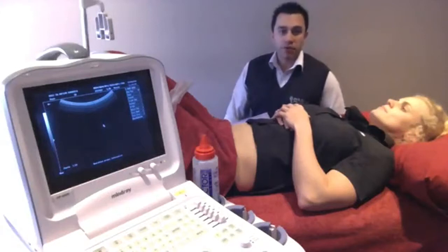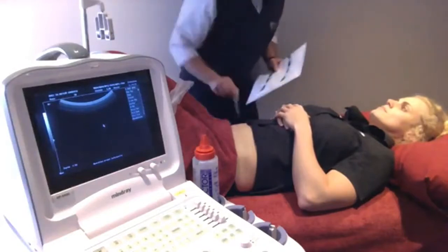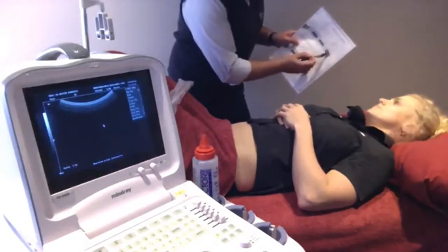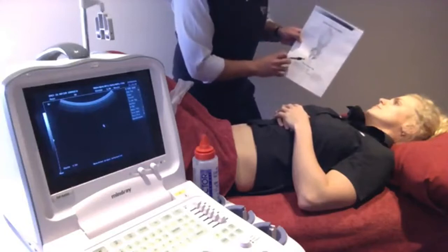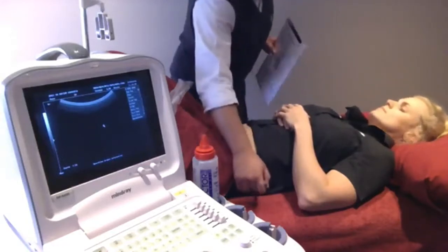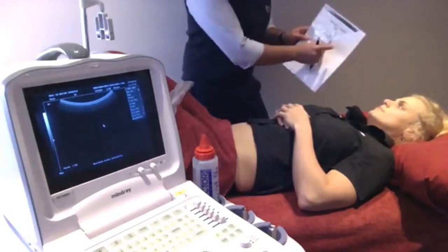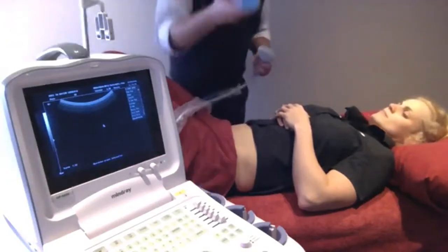Josie's been going away for a couple of days and working on activating her transverse abdominus muscle via touch, via palpation. Now we're going to use this machine right here — the real-time ultrasound — to have a look at those muscles on the TV screen. So Josie, if I was to cut you across the middle and look down, you've got your six-pack muscles, your external obliques, internal obliques, and deepest of all is your transverse abs. This muscle starts on your back and wraps all the way around to the other side — it kind of looks and acts like a corset does. When it contracts, it doesn't puff out like a bicep does; it'll actually tighten this way. It's this muscle that we lose when we hurt our back, and that's the one you've been working on. So let's have a look at that on the TV screen.